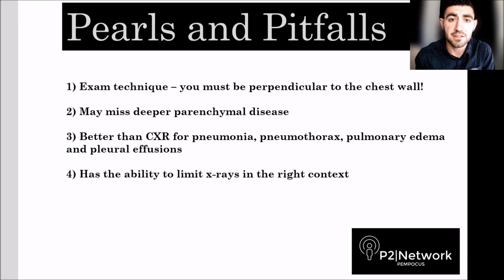Concluding the lung exam portion, here are some pearls and pitfalls. First, remember, exam technique is very important. You must make sure you are perpendicular to the chest wall to get a good image and make sure you bring out those artifacts. Secondly, sometimes we miss deeper parenchymal disease.